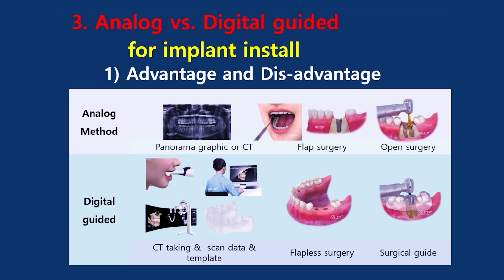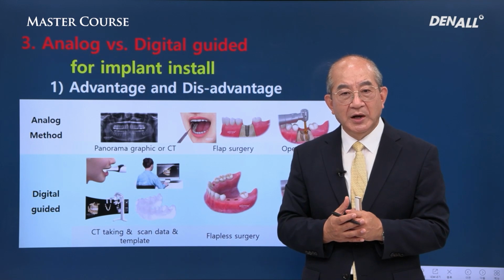Apart from difficulties arising from anatomical structures, what kind of advantages are there in digitally driven implant treatment when placing an implant? The biggest benefit is accuracy. Top-down method, we design the crown first. When implants were placed in conventional way, implants would often be placed in positions different from that of originally planned. On the other hand, if you use digitally driven implant treatment, because you already have planned for the position of the crown and placement positions are formed, you can accurately place the implant and get the expected result.